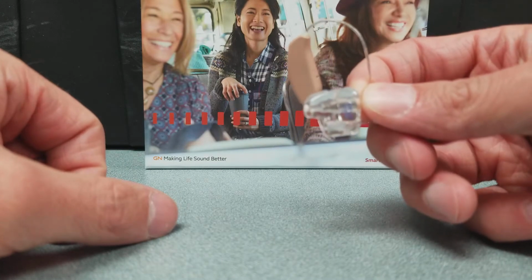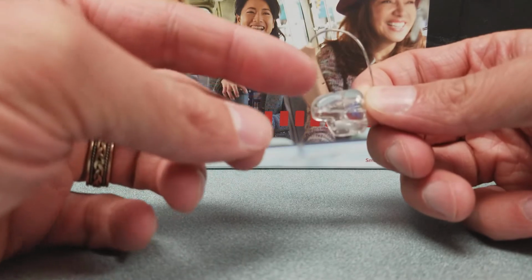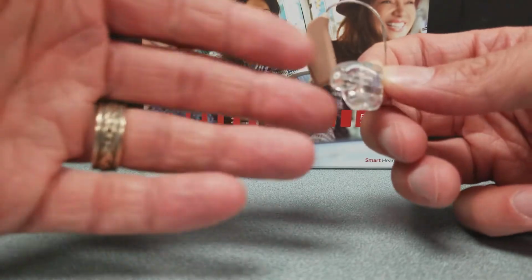This whole portion right here is called a custom ear mold. Okay. Yours might have a dome on it. We'll go over dome later. The custom ear mold will only fit the ears properly that it belongs into. So, you know, left goes in your left ear.